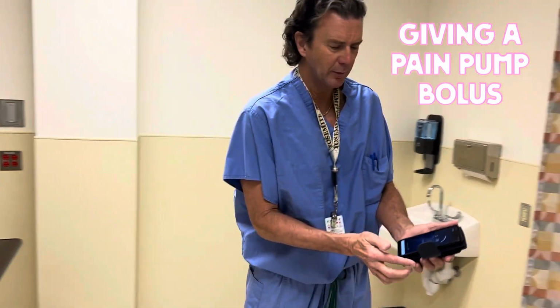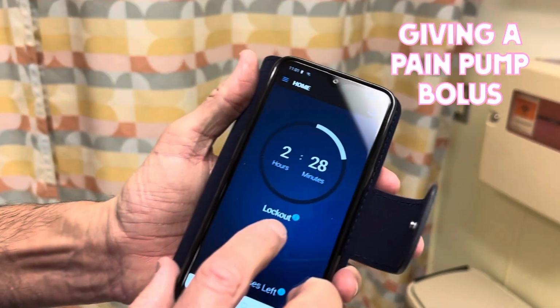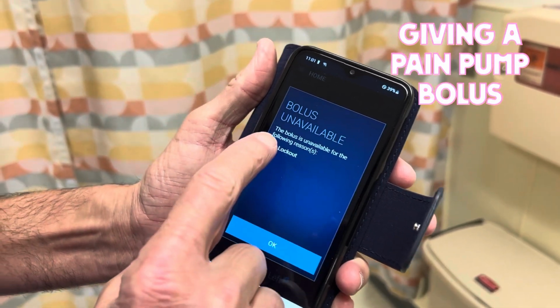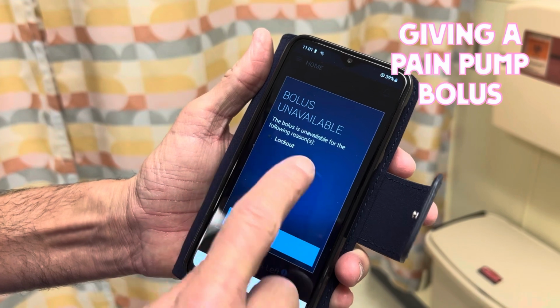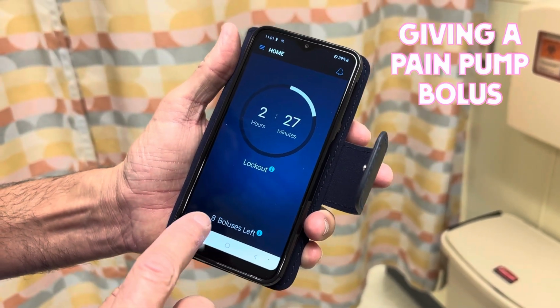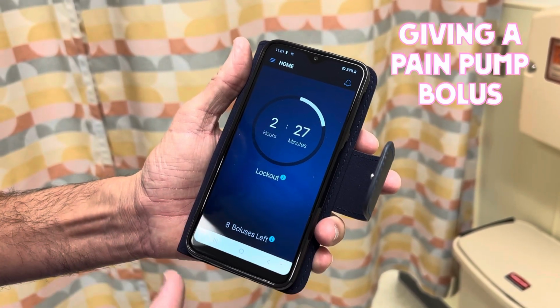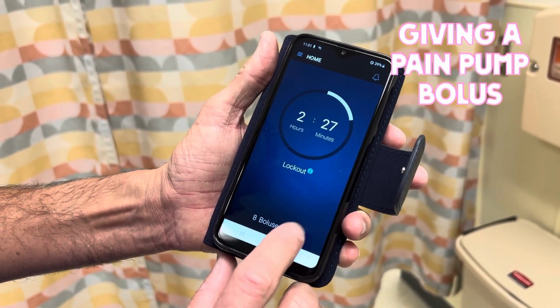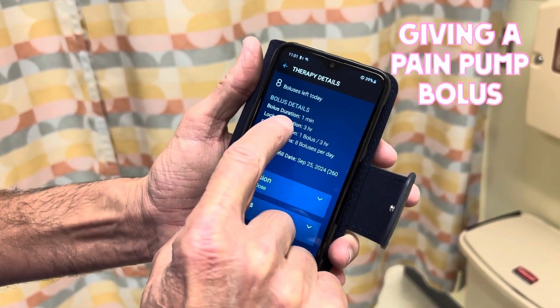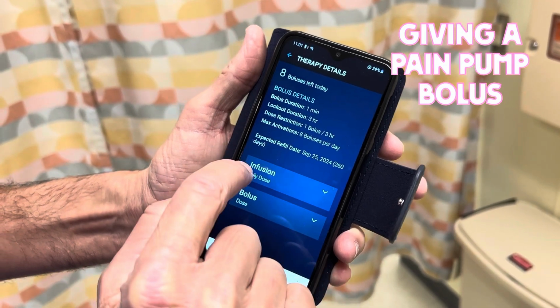Now the other thing you can do is, on this screen where it says lockout, if you push the blue eye, it tells you that the bolus is unavailable, it's locked out. If you go down to the bottom of the screen, it says 8 boluses left. This tells you how many boluses you have left in that 24-hour period. And if you hit that blue eye, it'll show you your bolus details. Your bolus duration is 1 minute. You can do it every 3 hours.